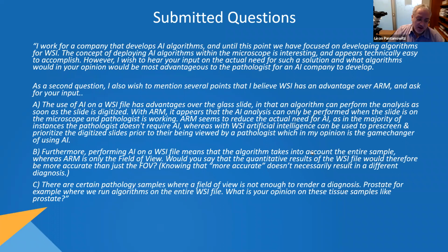The second thing is, if you're making AI for whole slide imaging, there's no reason you cannot apply the same AI to augmented reality microscopy. What this person asking the question points out is that there are advantages to the WSI. And I would say that actually one of the problems today with people making AI algorithms for whole slide imaging is they are making AI algorithms to replace pathologists and not augment pathologists, which is a huge problem.